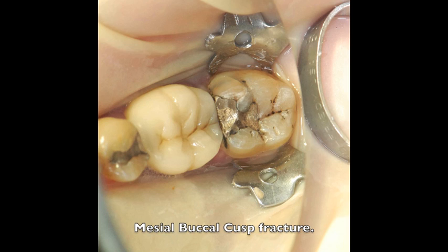Here we have a clinical case of a lower molar where the mesial buccal cusp is about to fracture. When this piece breaks off or the tooth is prepared, it will be difficult to place a matrix band and prevent the separating ring from crushing the matrix band into the box.